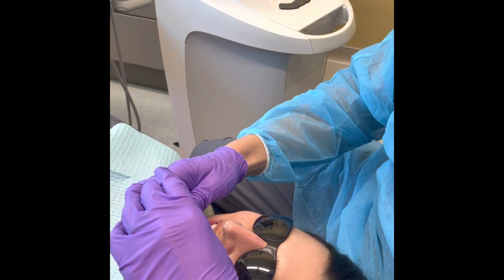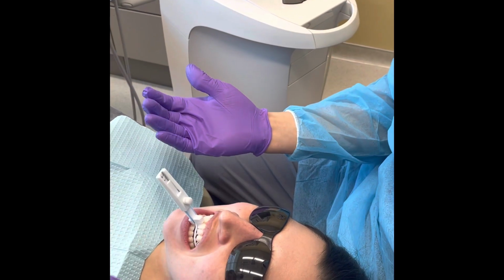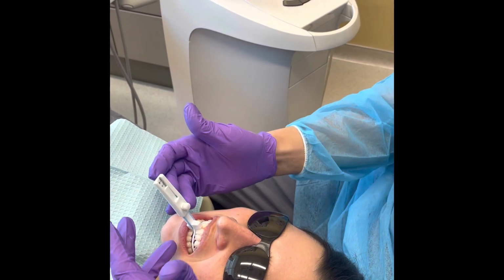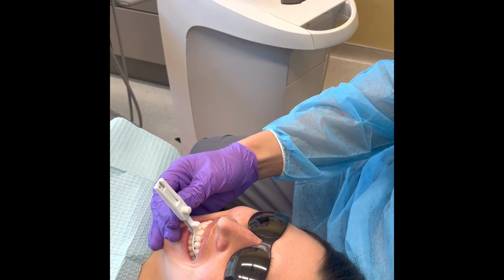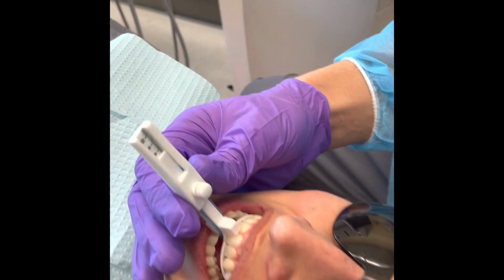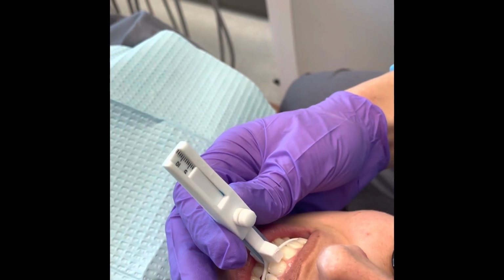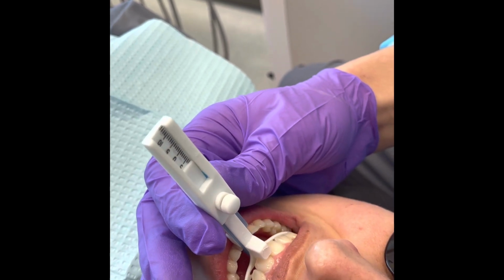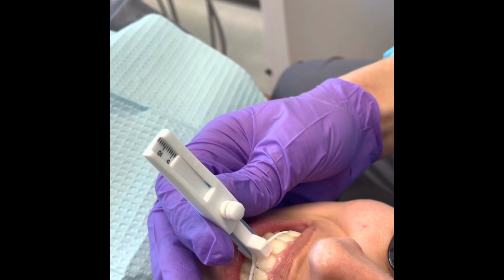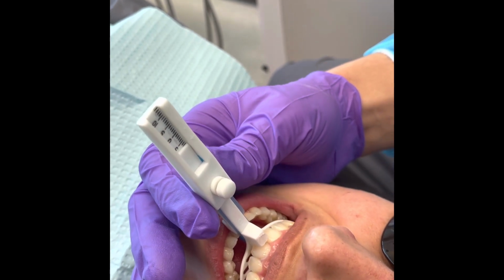I'll make sure that my bottom thumb screw is tightened. I want my left or top thumb screw to be loose. So what I want you to do, Dr. Dainty, is go ahead and slide your jaw back as far as you possibly can. Okay, so we're at +5 all the way forward for me. And 7, okay? Slide your jaw back. So 5, slide your jaw forward. 7. One more time. 5 to 7. So we have 12 millimeters of movement.